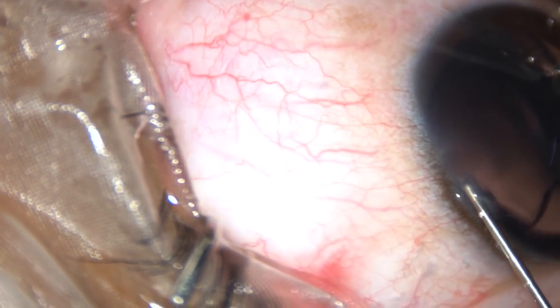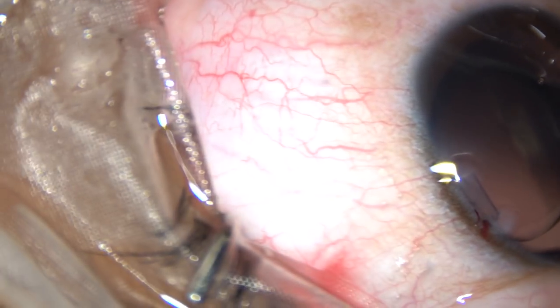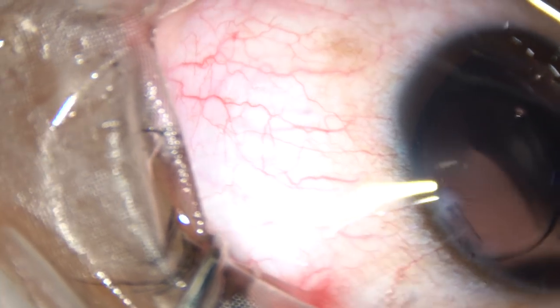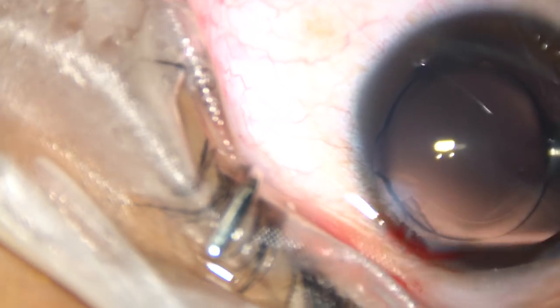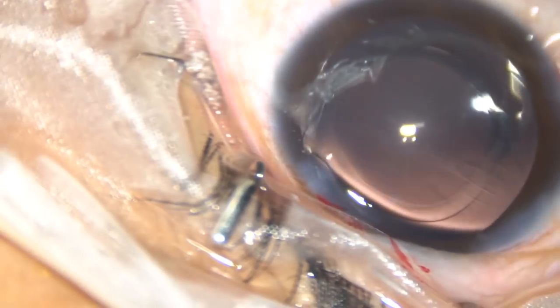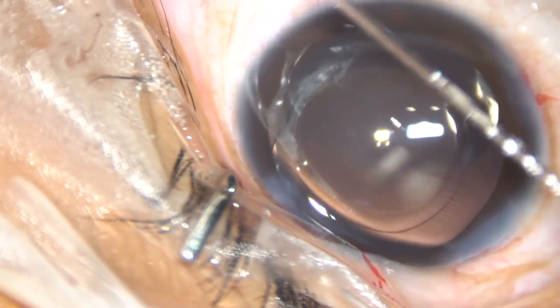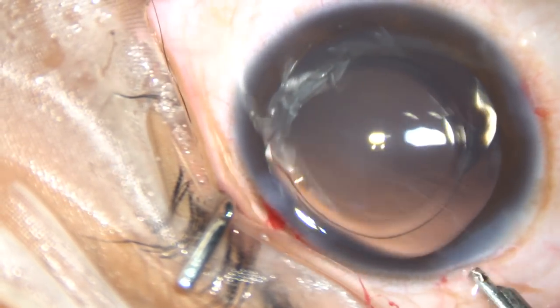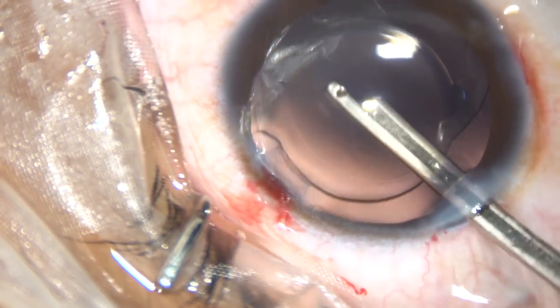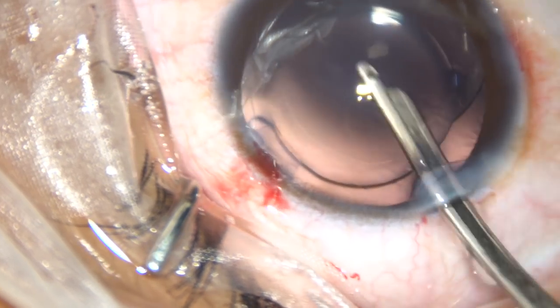You can see the left side port is large because the eyeball turned sharply. Now this is the final lavage of the anterior chamber. The anterior chamber is irrigated thoroughly, the anterior chamber is formed nicely, and the case is concluded.